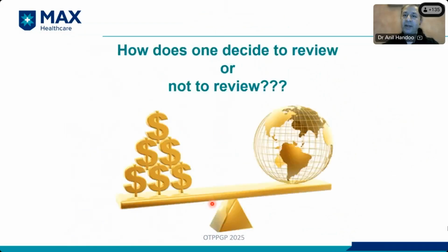And he says, so how does one decide in your system whether you will review or not review? And that's the time when he gave me a non-conformity and said, you have to create what is called a slide review criteria definition in your laboratory, to ensure that you do not miss anything, or overburden yourself by making too many smears to see.